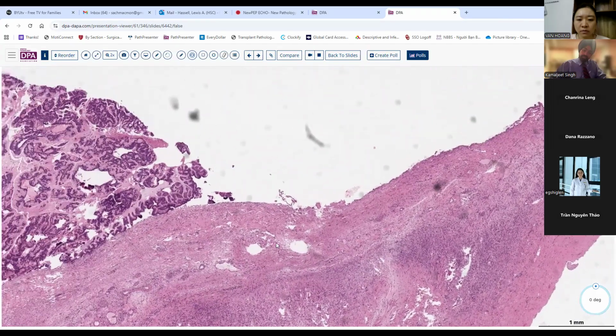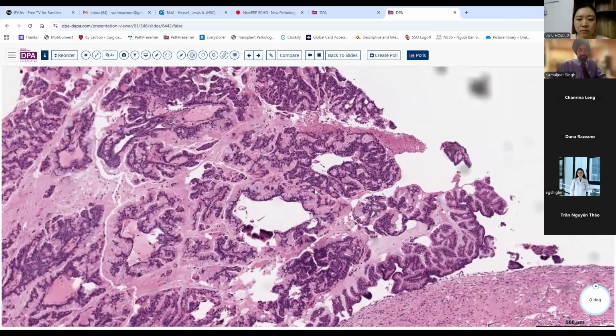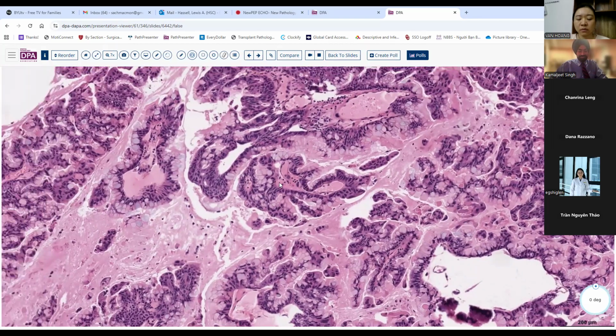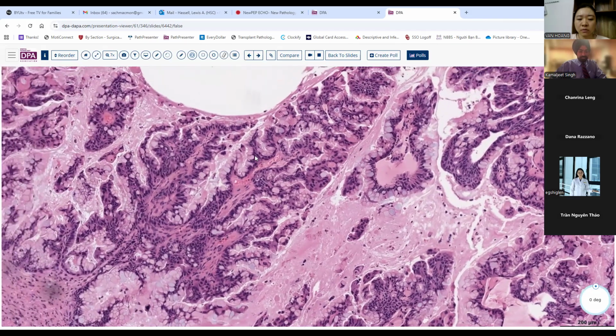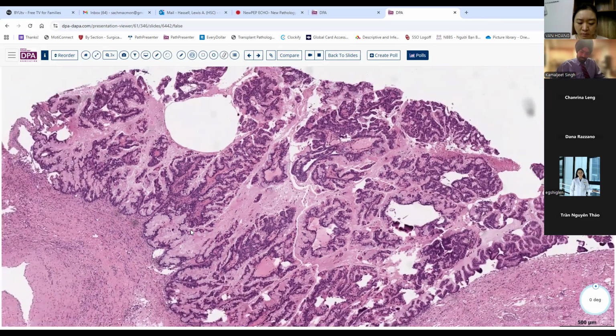Here's our cystic element, and then here we have the epithelial component. And as you can see here, we have a combination of sort of goblet cell, mucinous type of epithelium, maybe with some other elements. And so in this situation, we've got a mixture of stroma and mucinous elements that would make us be concerned about possible metastatic disease, possible primary mucinous tumors.